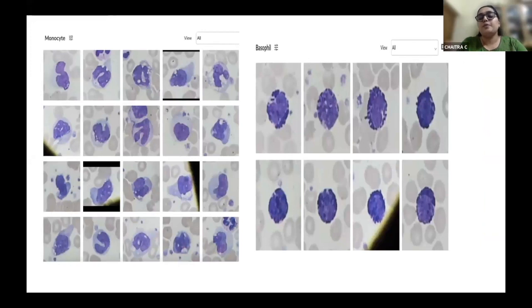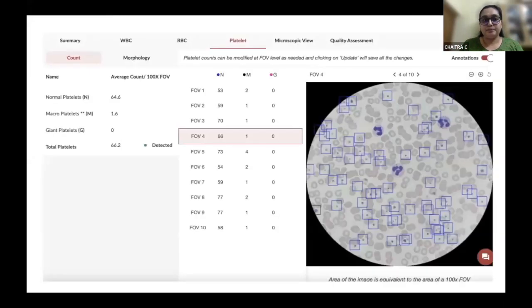we had monocytosis, and there was basophilia. So AI100 not only picks up neutrophils, lymphocytes, monocytes, and eosinophils, it also has a high sensitivity and specificity for identification of IGs, basophils, and blasts as well. This case had thrombocytosis.